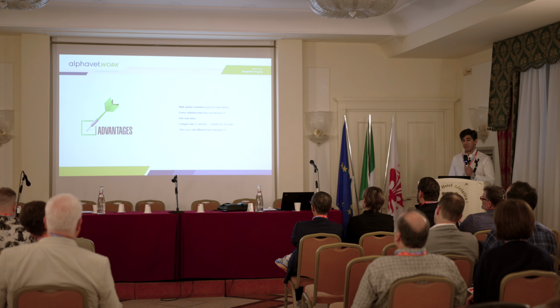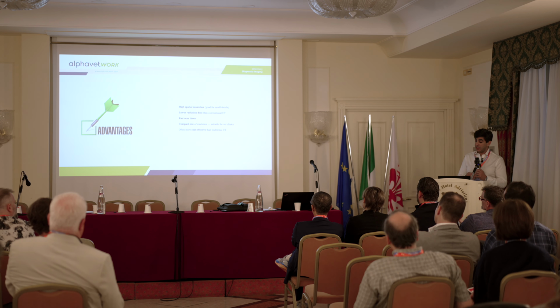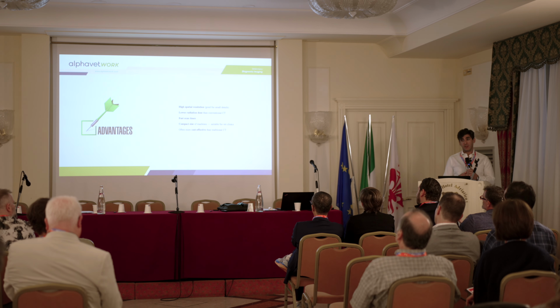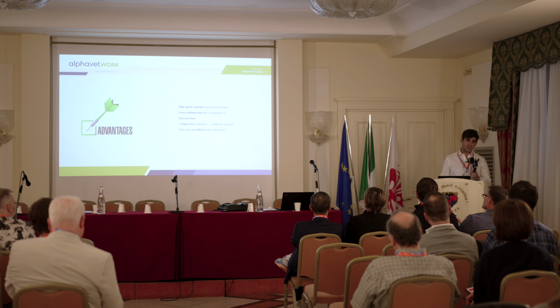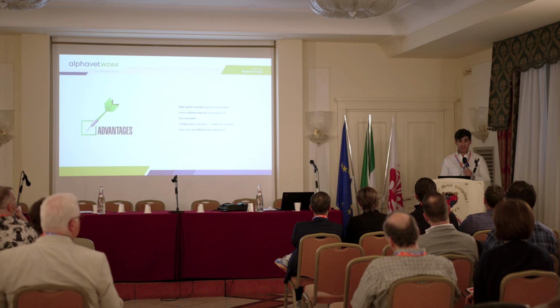So what are the advantages that we have with this technology? We have a high spatial resolution, good for small details, lower radiation dose, fast scan times, a compact size of the machines, and it's cost effective. I'm the owner of a diagnostic imaging center, and I have both a CBCT and a CT. For a big CT unit, I'm paying 5,000 euros per month only for maintenance. So a CT costs a lot.